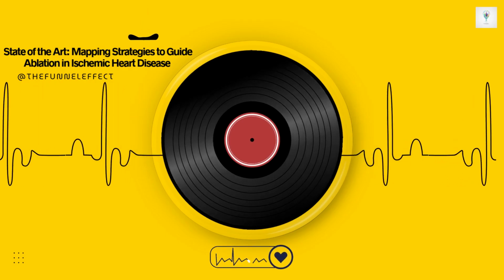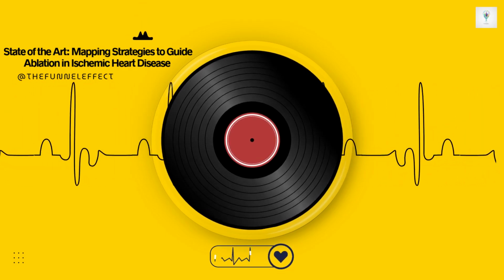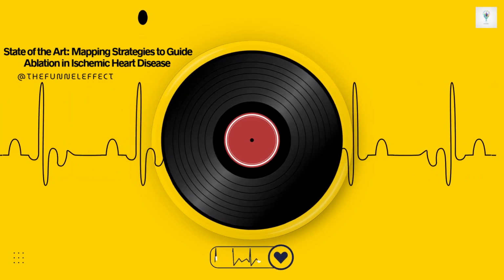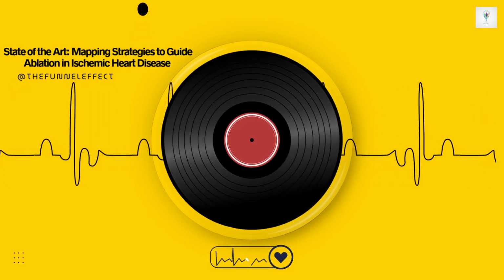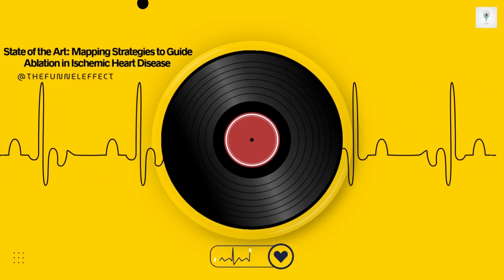Okay, so you have a map of activation times. How do you use that to find the slow conduction zones, the potential isthmuses? You look for areas of isochronal crowding. An isochrone is just a line connecting all the points that activated at the same time. Think of it like contour lines on a topographic map.